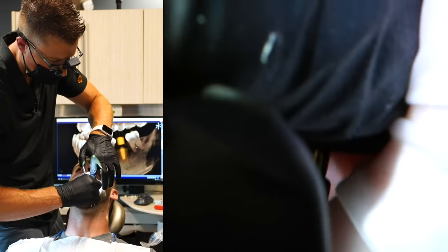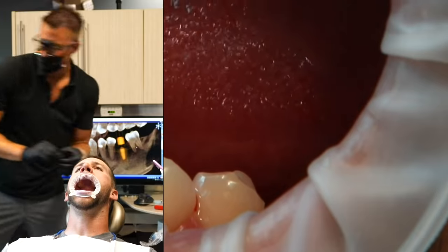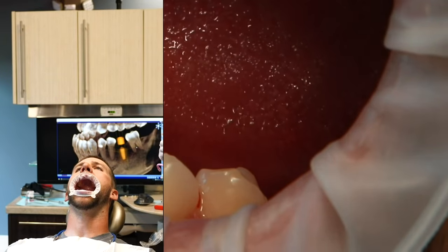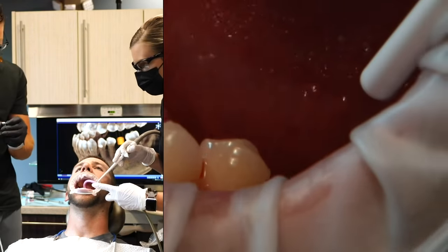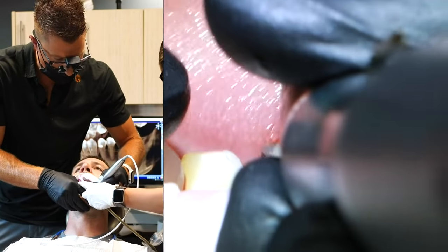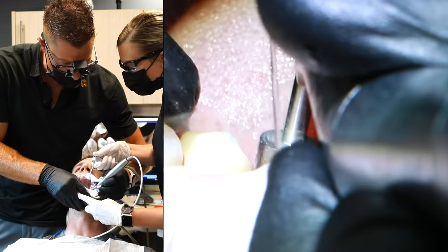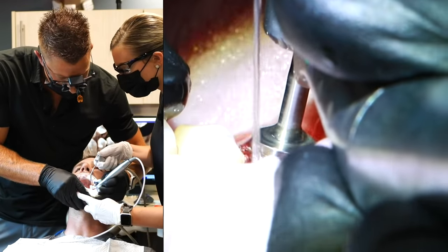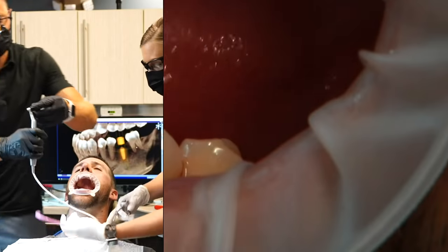Place a little profiler in there, and it allows us to shape the tissue a little bit to where we get a more nicely contoured future crown for him. So it'll just help us deliver a crown that has less, I don't know if anybody's had implants, they can probably attest to it, if they're not done really, really precisely, they can be a big time food and plaque trap. So this is a way for us to help avoid that issue. We can get rid of those spots where teeth are gonna have an issue with trapping plaque and food debris.